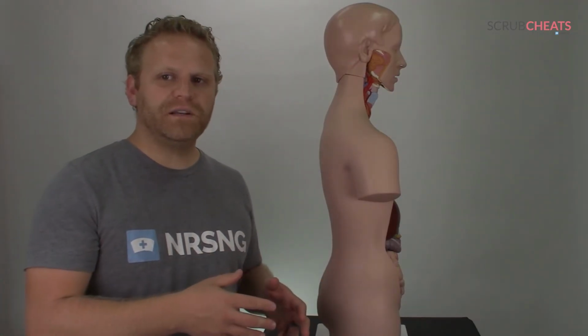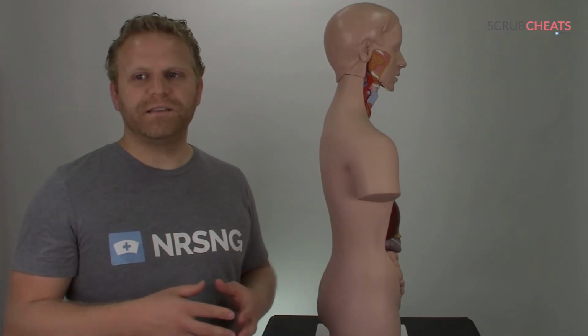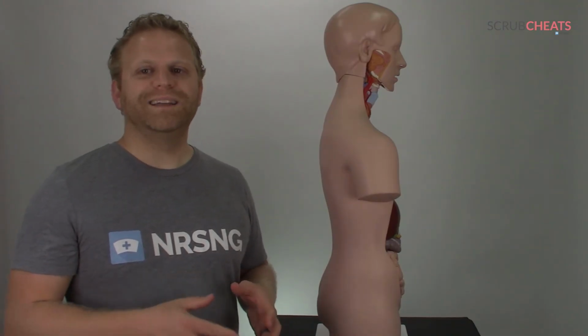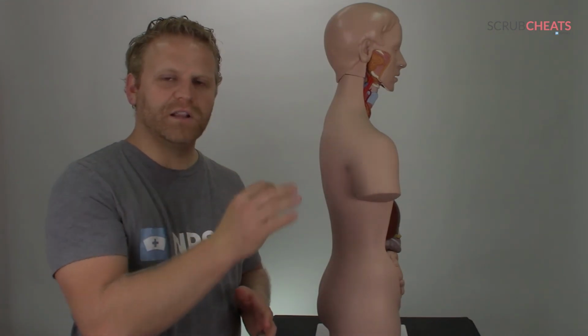A very large patient can handle 2 mils and a 1.5 inch needle. However, a very small, frail patient would require a 5/8 inch needle and no more than 1 mil injection. And remember, intramuscular injections should be administered at a 90-degree angle with a gentle, dart-like motion.